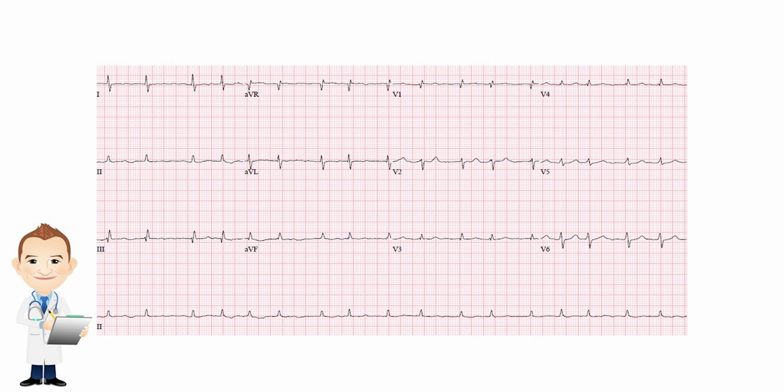The axis is okay — leads I and II are both facing upright. So this is basically AFib. When it's irregular, you have two options: if there are multiple different morphologies of P waves, it's MAT; if there are no P waves whatsoever, it's AFib. And in this case, this is just AFib.